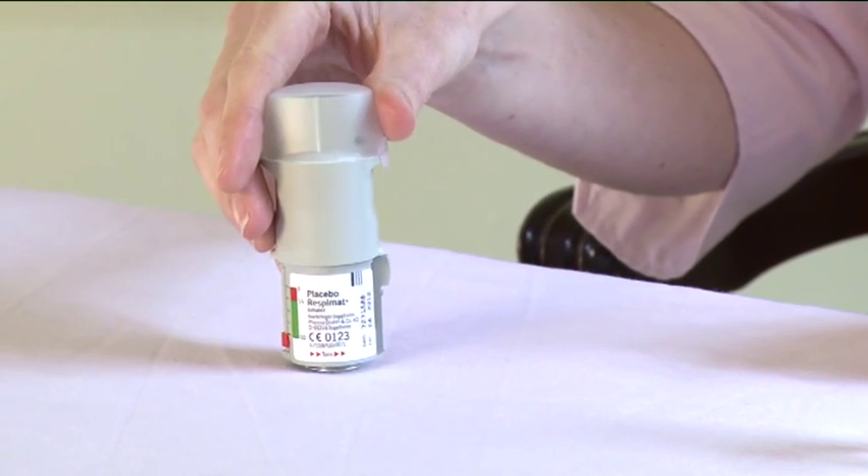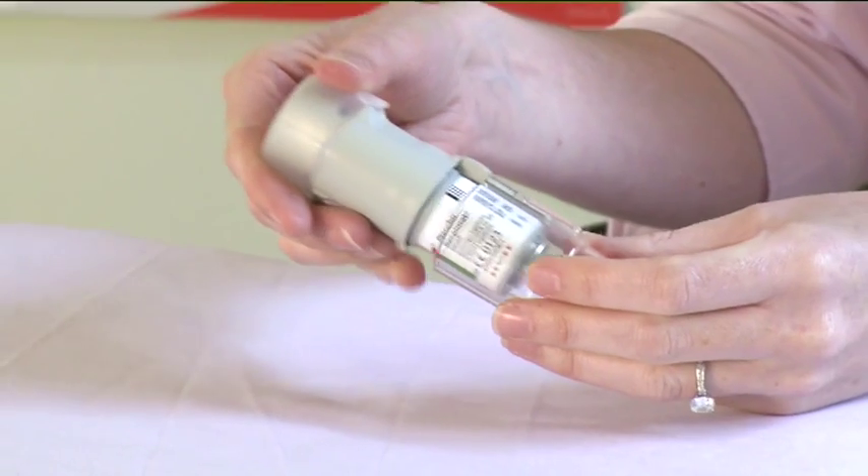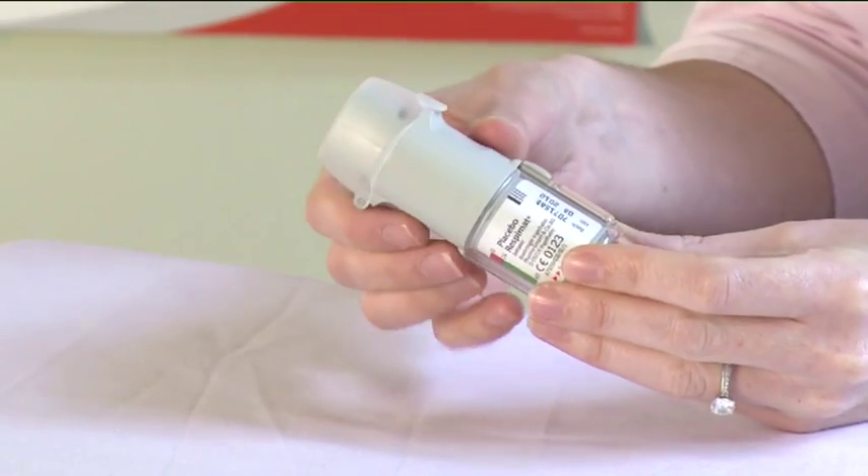Do not remove the cartridge once it has been inserted into the inhaler. Replace the clear base. Do not remove the clear base again.